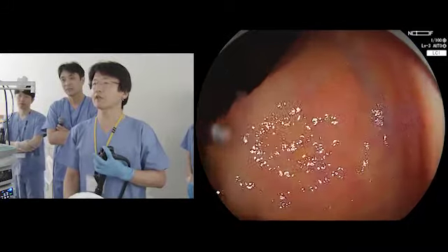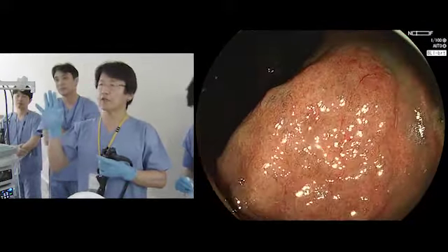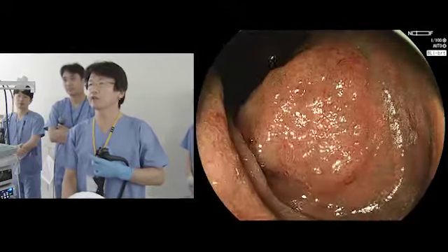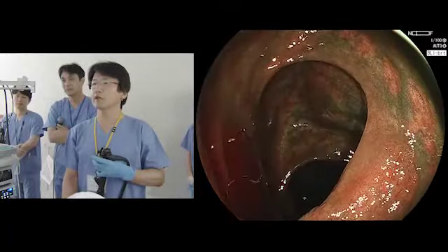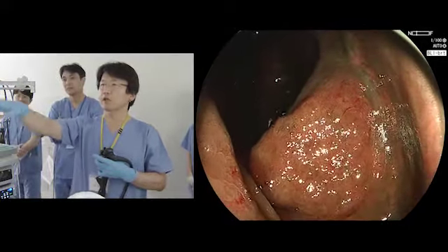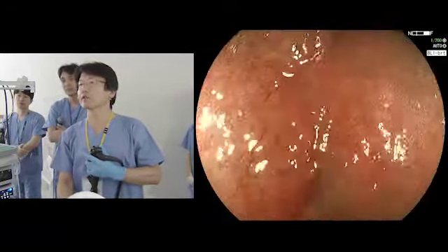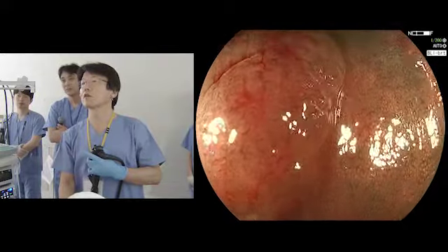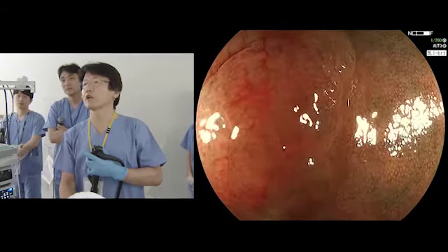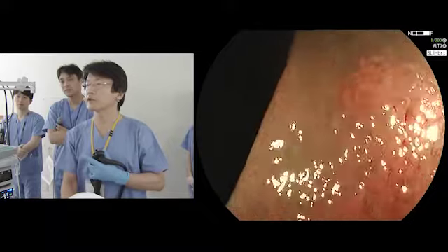And before that, I want to show you the BLI. After a lesion is detected by LCI, I change to BLI, and this is the BLI bright mode. BLI bright has a brighter image than BLI or NBI, so you can see the demarcation clearer. And with magnification, you can see the pit pattern with some vascular pattern. So you can recognize the demarcation even in this kind of very unclear SSAP lesion.